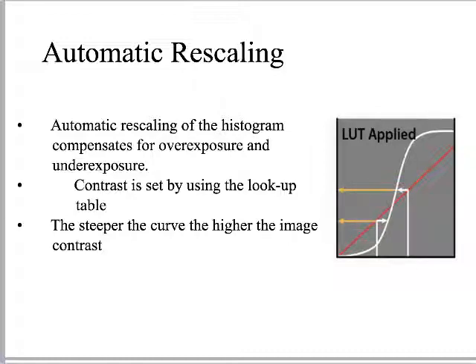The same thing is happening when we look at the lookup table from the point of view of contrast, right? So we've done all of these operations to give ourselves a pretty picture. We've defined the volume of interest. We've told it what we want the end picture to look like, right? Now, though, we've got to rescale it to what the human eye perceives as contrast.